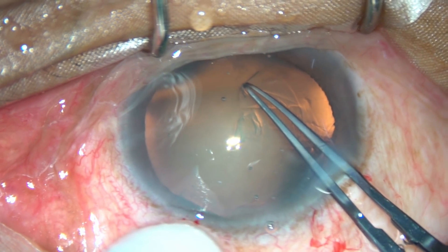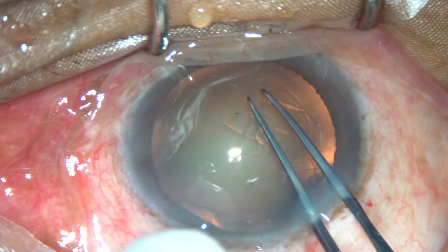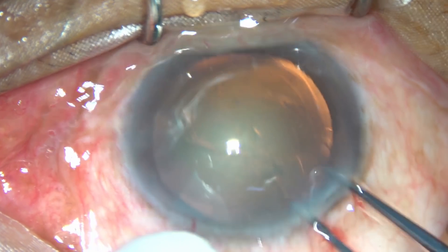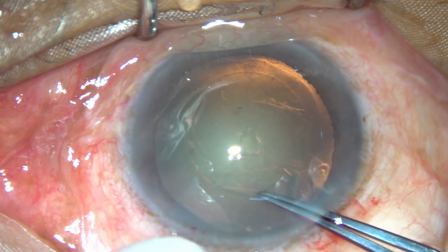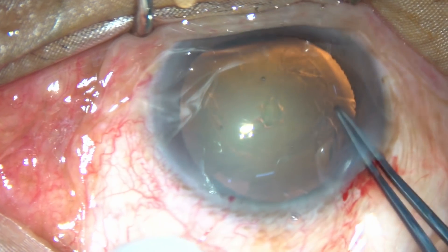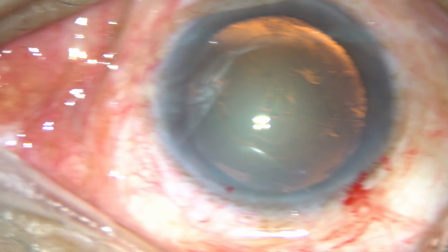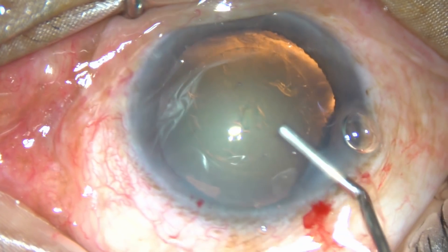Friends, this is another case of no hydro phaco. After the initial steps, capsulorexis is being done at this moment. You can see that the rexis is not large — it is as usual about 5mm in diameter. And now, no hydro.